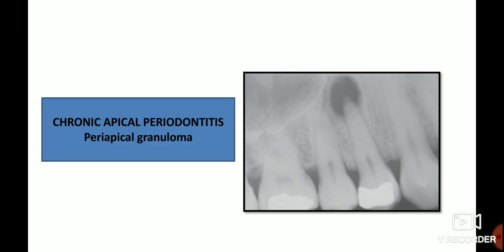Now let's discuss another intraoral periapical radiograph showing chronic apical periodontitis, which can also be called periapical granuloma. It is only a radiographic diagnosis and never a clinical diagnosis, because it can be identified only based on the radiographic size of the periapical lesion.